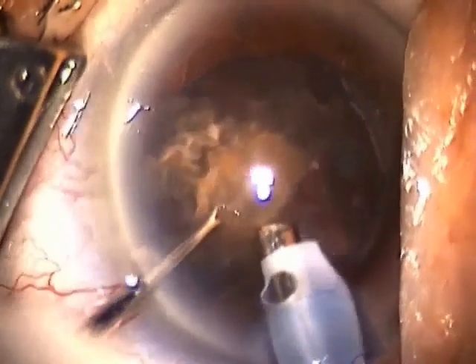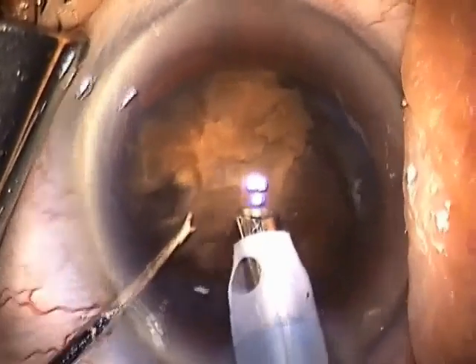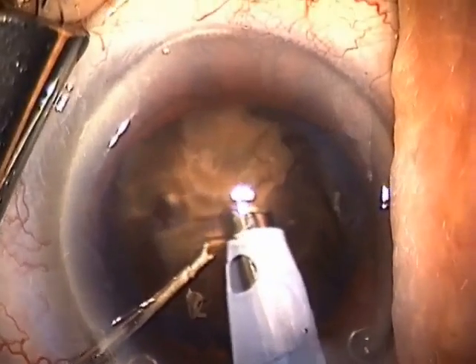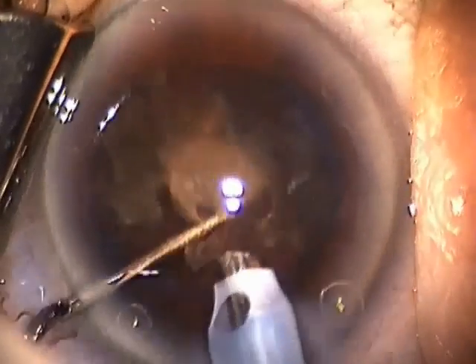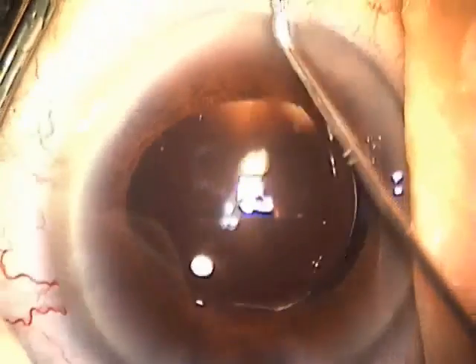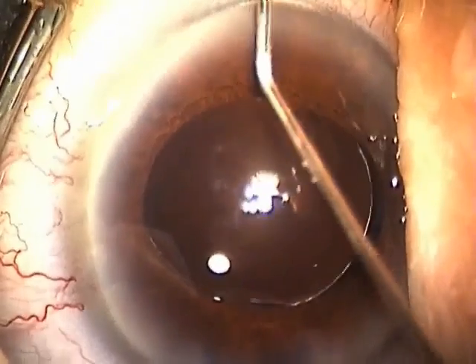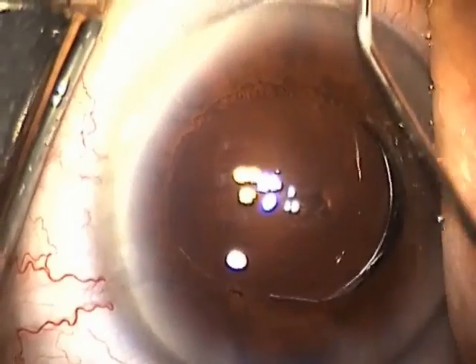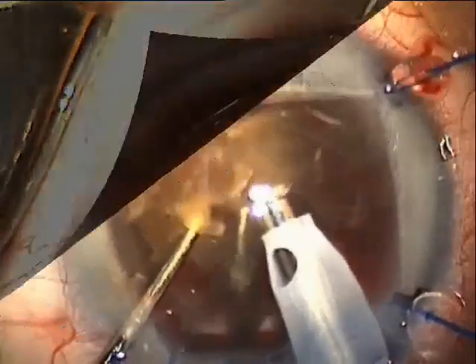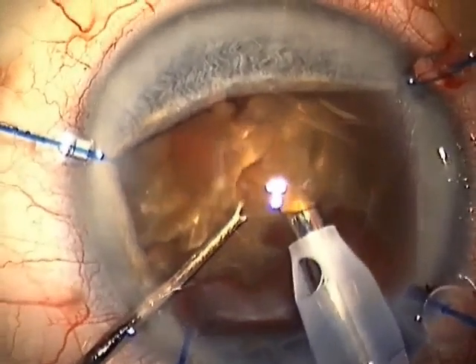This lens is just a rock. We've edited this quite a bit and stopped from time to time to put viscoelastic in to protect the corneal endothelium. But you can do cases like this with the Stellaris and have them come out close to 20/20 the next day, as long as you stop to use viscoelastic to protect the cornea. Exquisite control with the Stellaris unit. You can see how nice the cornea looks — with the Stellaris and also the Millennium, I've never had a wound burn in probably close to 50,000 cases.